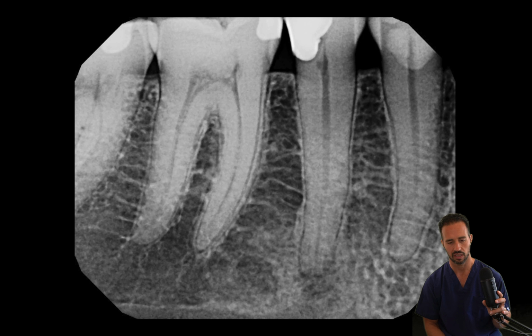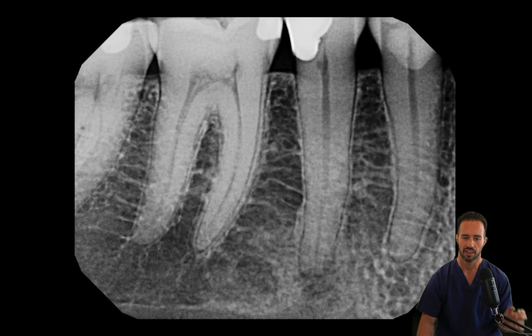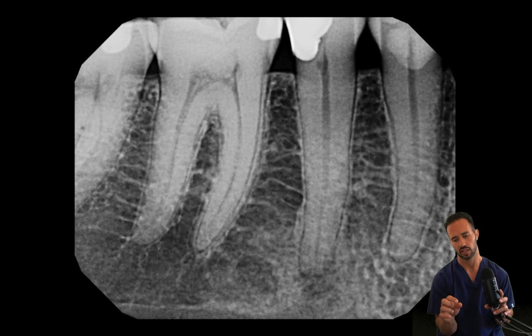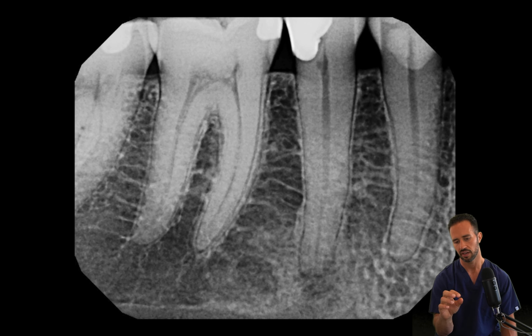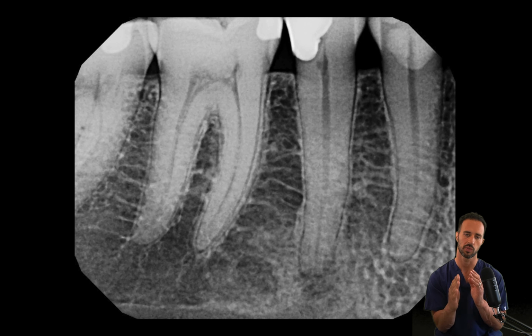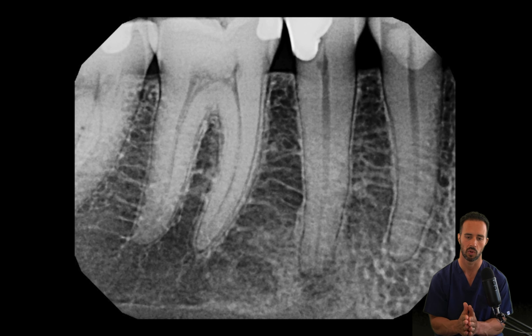You can see very clearly on the periapical film that the restoration appears to be very, very close to the pulp, and you can hopefully see the lesion on tooth number 29 in the apical area. You'll probably also appreciate the radiolucency between tooth numbers 29 and 30. That's going to be your mental foramen. It's usually between the premolars. Here it appears to be closer to the area between the second bicuspid and the first molar. But nevertheless, the lesion's obviously there.